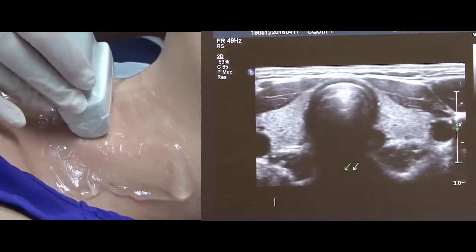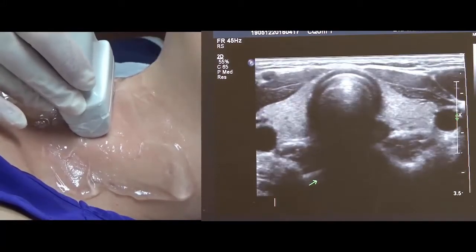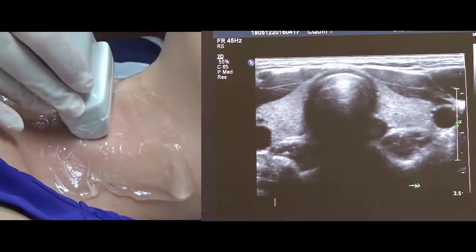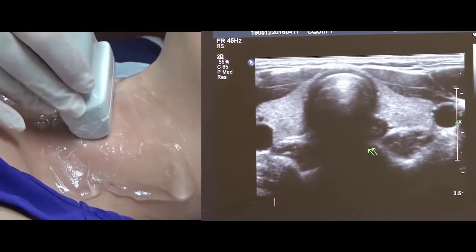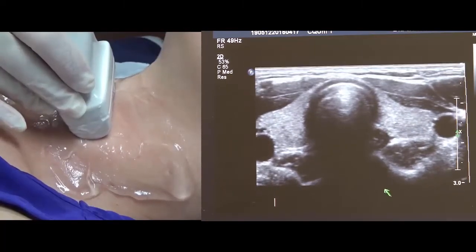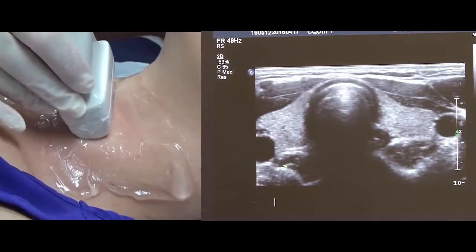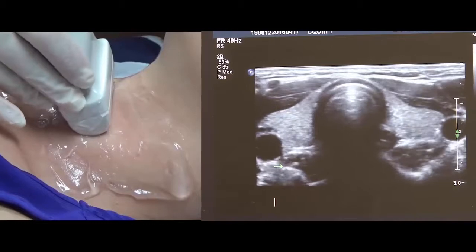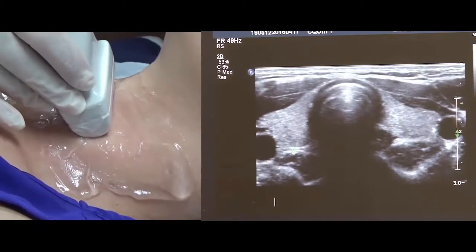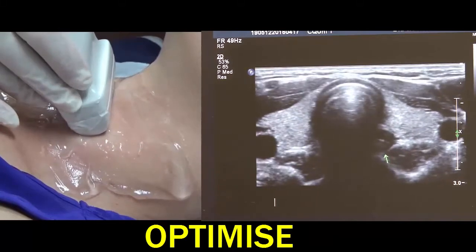Coming down posteriorly as well, from our esophagus, we've got our bony landmarks, our bony structures. If I come down a little bit further, this is all blackout because this is down into the neck cartilage. So we don't want to set our depth too deep. You want to make sure you're just seeing the bony landmarks there, and your longus colli muscles are going to be in that posterior section. So we know we've got our landmarks. We can confirm all of those landmarks are correct and that it's fitting on the screen.